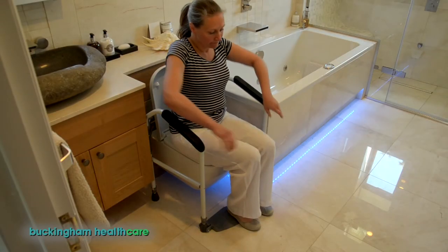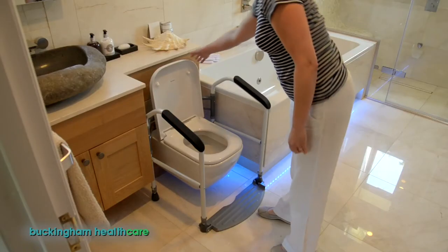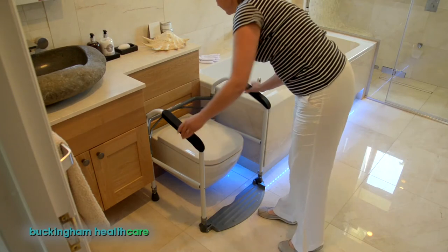Once you're ready, use those same armrests to lift yourself off the toilet, your feet still firmly on the footplate, making sure everything remains stable.